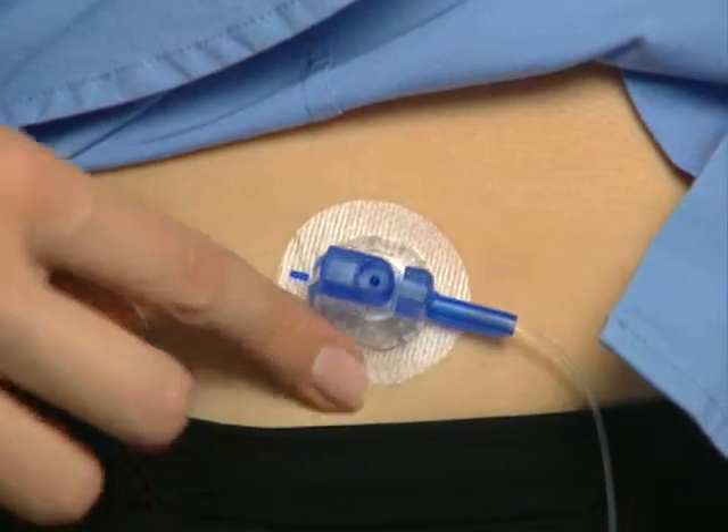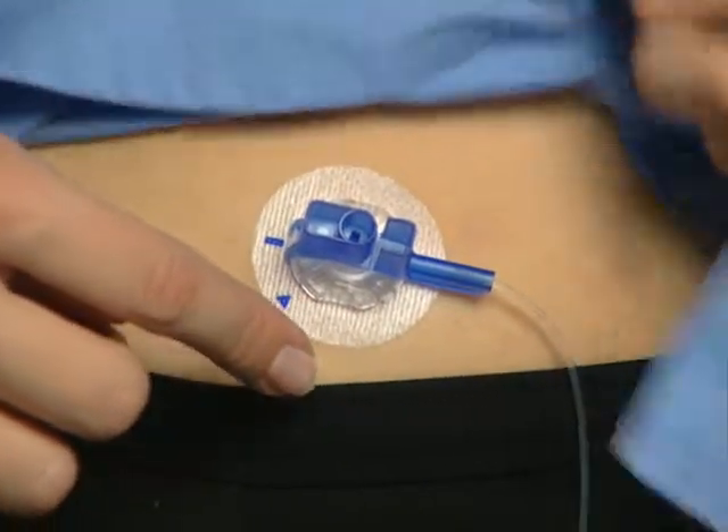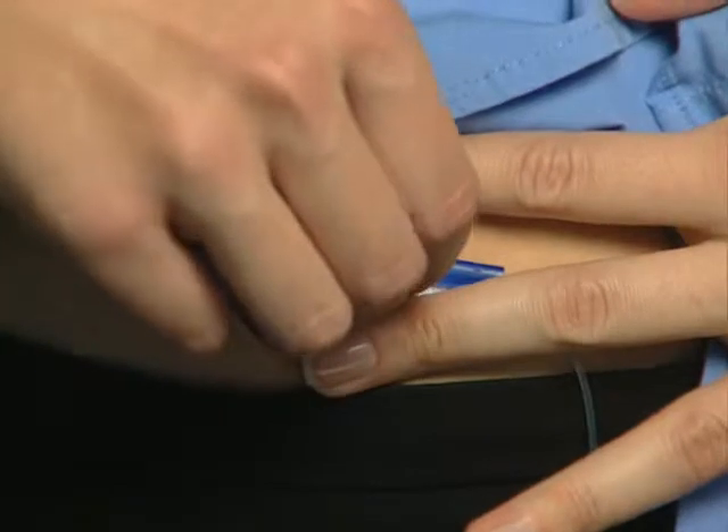Gently smooth down the adhesive around the site. Remove the blue needle hub by pulling it away while holding down the adhesive.